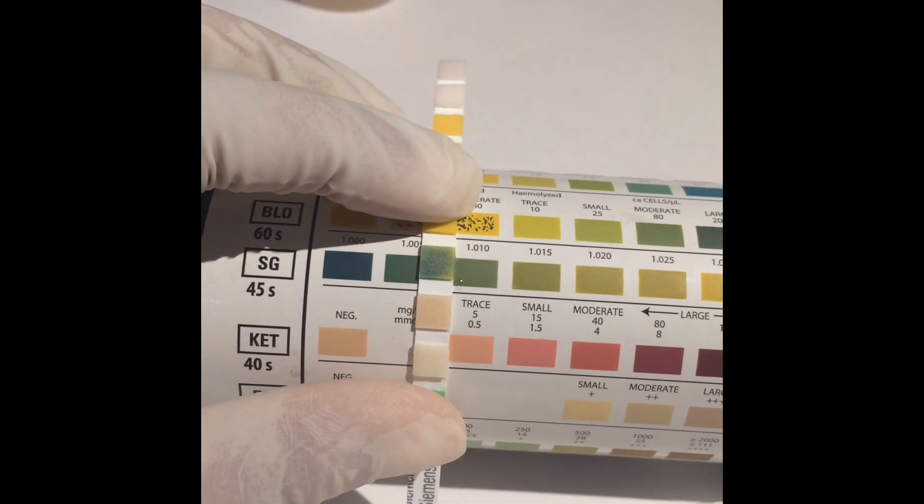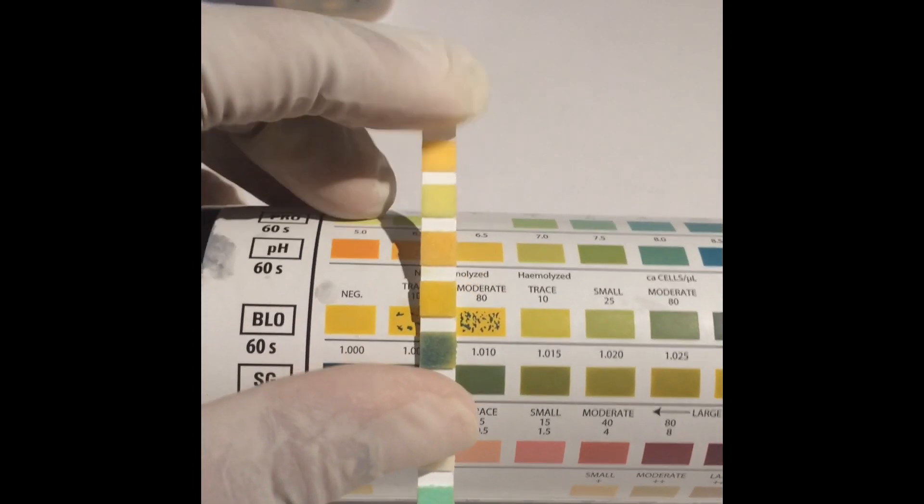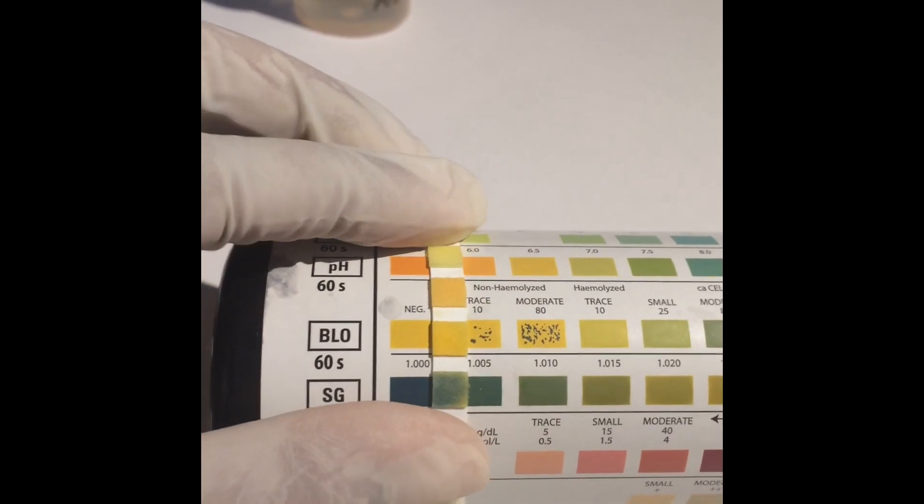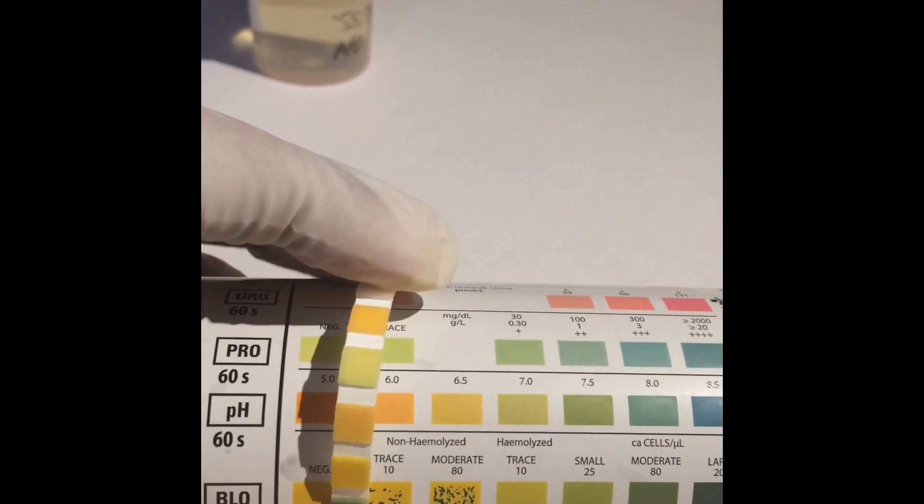pH 6.5, slightly acidic. Urobilinogen would be negative.